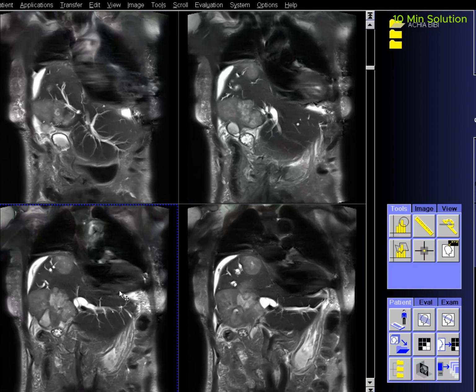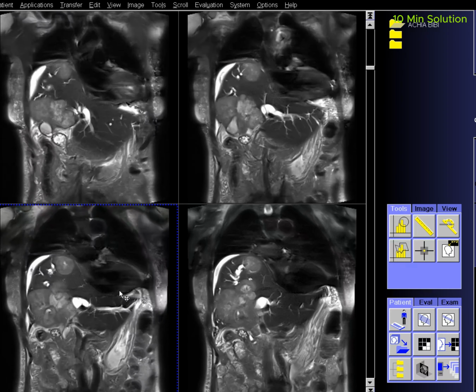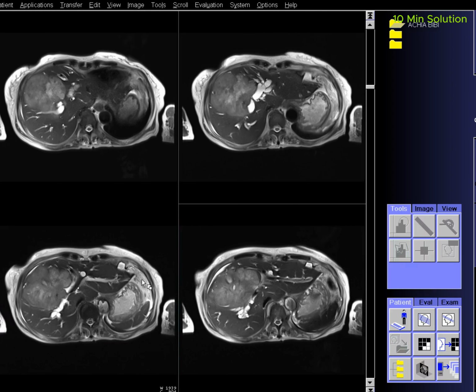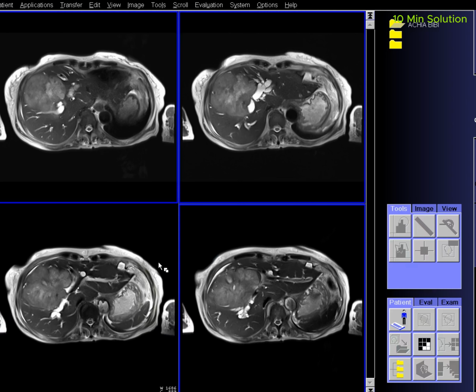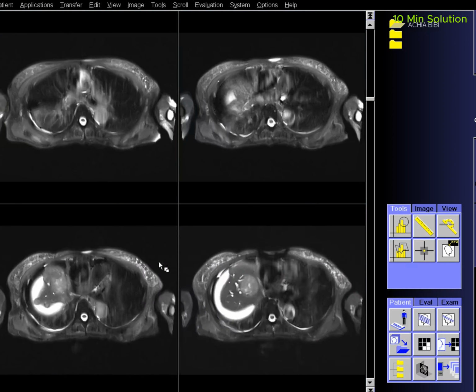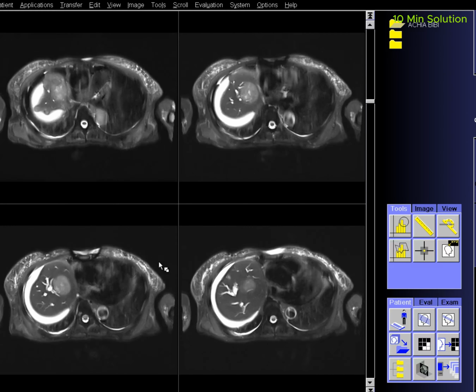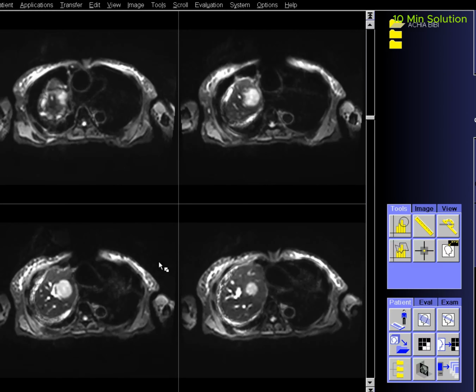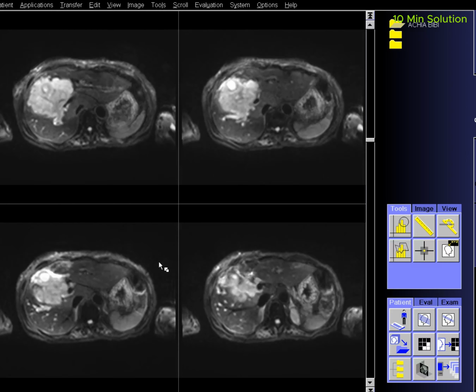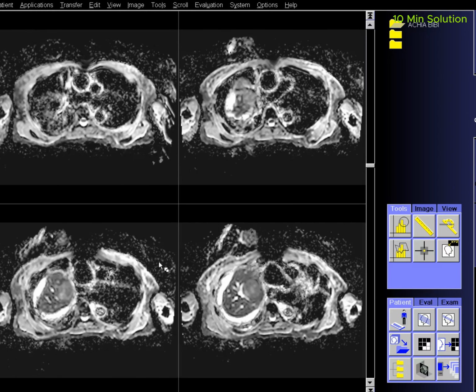Contrast agents for liver imaging. Intravenous contrast can enhance the sensitivity and specificity of MRI scans for lesion detection and characterization, as well as differentiate between benign and malignant liver masses. Contrast enhancement characteristics are frequently utilized for specific diagnosis of pathologies. Multiple contrast agents are accessible for liver imaging, including nonspecific extracellular contrast agents, hepatocyte-specific contrast agents, or a combination of both.